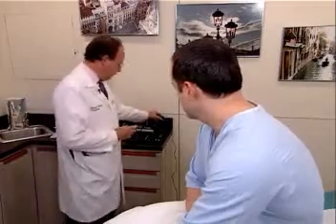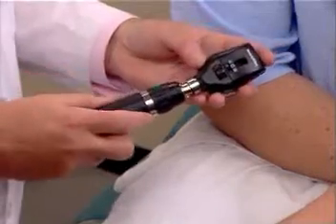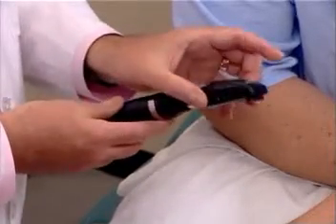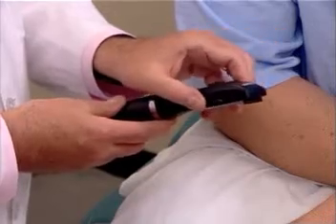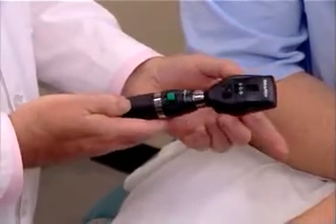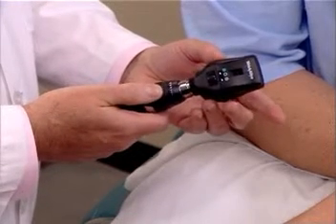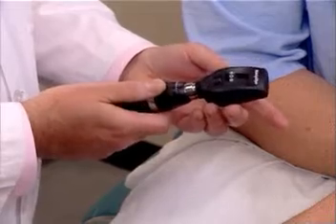I'm going to demonstrate the use of the ophthalmoscope by using 3 different types of equipment. The first is the standard direct ophthalmoscope. A direct ophthalmoscope is an instrument which has a series of lenses which takes into account your refractive error as well as the refractive error of the patient. It's a light source which allows visualization of the cornea, the lens, the vitreous, and the retina.